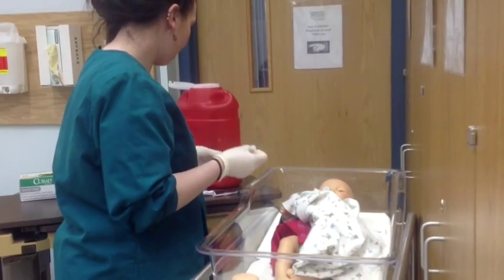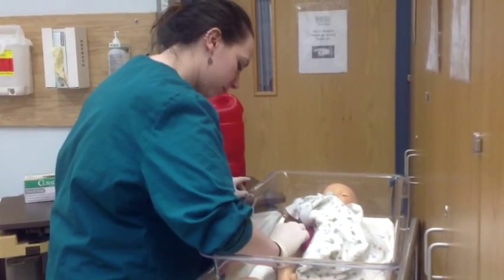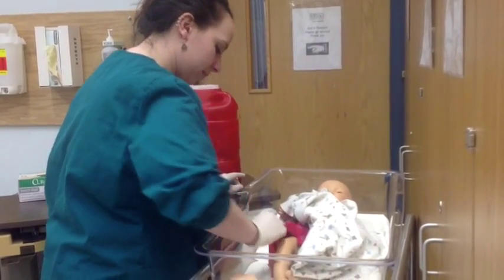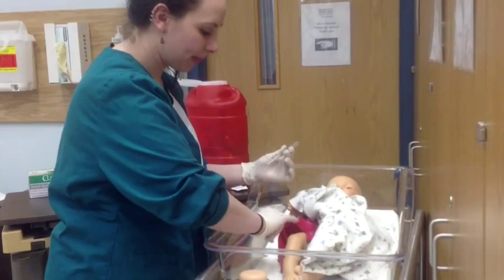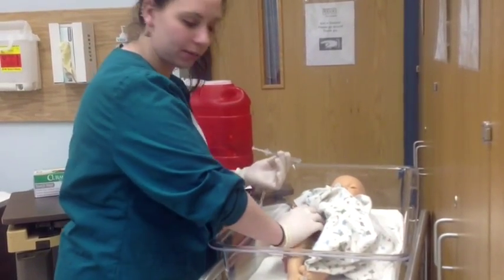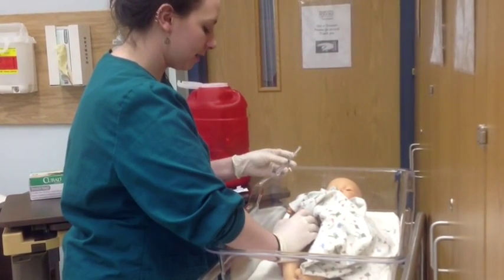So, I'm going to take the alcohol swab, and you're going to just clean the area that you're going to do it in, and then you throw it away in the trash bin. Now I still have the safety on. I'm not going to actually inject the baby. This is a little bit harder, so we're going to try this out. So you're going to pull the safety back.